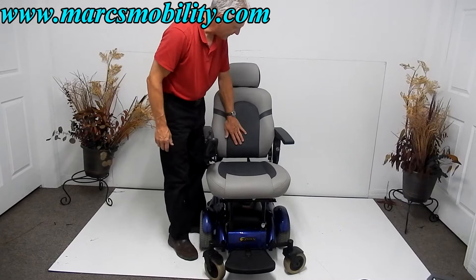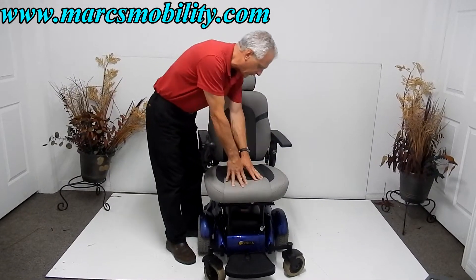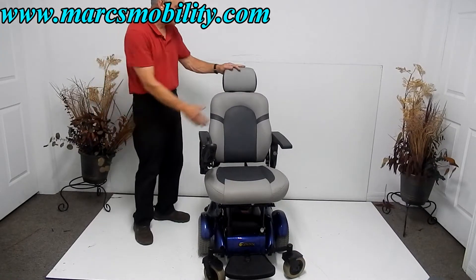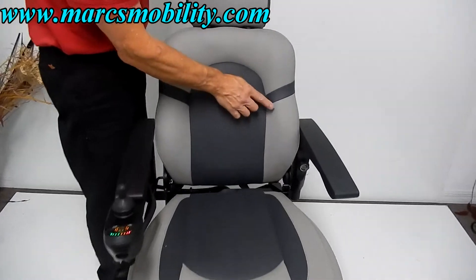It has a short foot plate right under the chair, which gives you a couple of extra inches of turning radius. The seat is 20 inches by 20 inches and is a very comfortable seat.